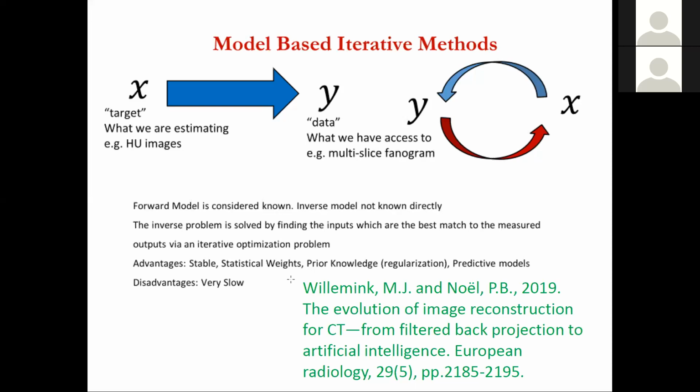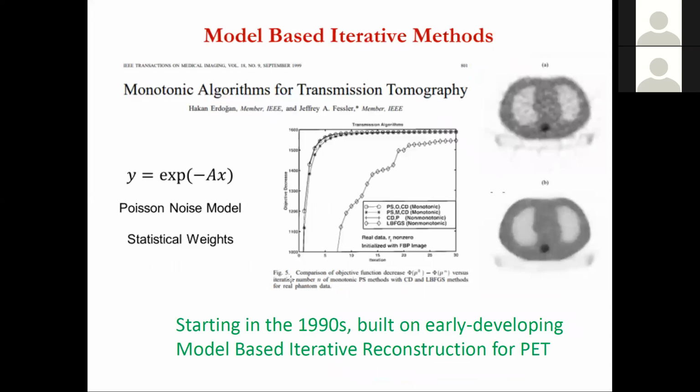You have essentially a parametrized response, which is your system response matrix. You have the geometry, which is going to map you just about as efficiently as what you were doing with filtered back projection to go from the image space to the projection space. But then you have to go through and do this update. So at each iteration step, you go from the source to the projections, and then take the difference between the projections and what the projections would have been given your current estimate of the source, and you update the source and go around and around, doing a bunch of iterations. So computationally, you're accessing the whole system matrix. There's a bunch of computationally costly things, but that's what you do for iterative reconstruction, and the advantage you get is it makes a lot of your artifacts go away.